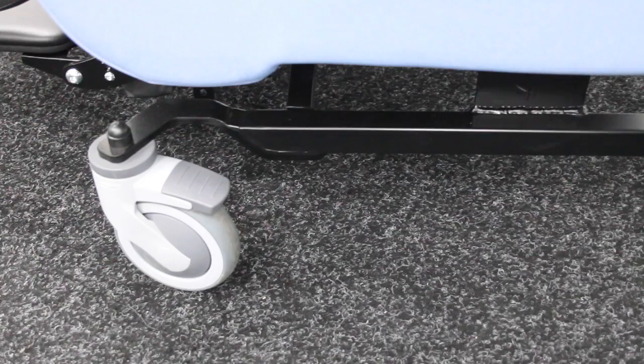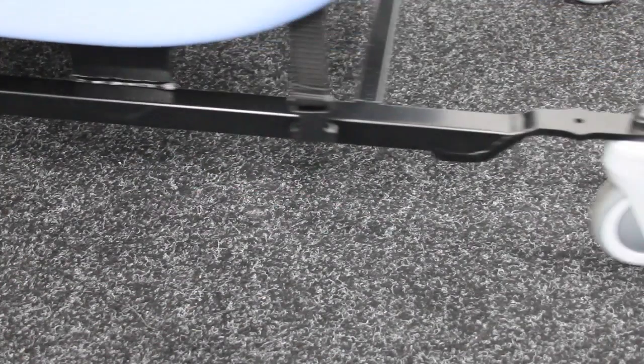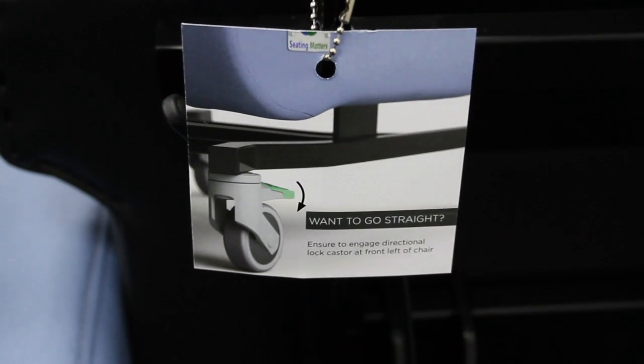To engage the directional lock caster, you can click here with your foot. If you aren't sure, you can refer to the label on the back of the chair.